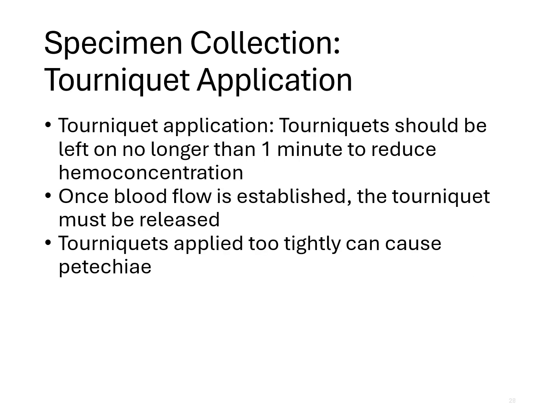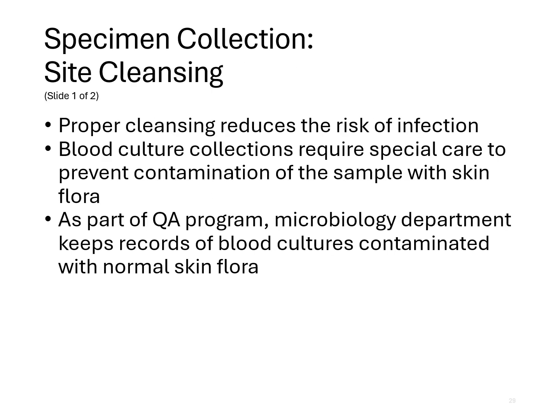For tourniquet application, tourniquets should be left on no longer than 1 minute to reduce hemoconcentration. Once blood flow is established, the tourniquet must be released, and tourniquets applied too tightly can actually cause petechiae in some patients. Site cleansing, proper cleansing will reduce the risk of infection. Blood culture collections require special care to prevent contamination of the sample with skin flora.